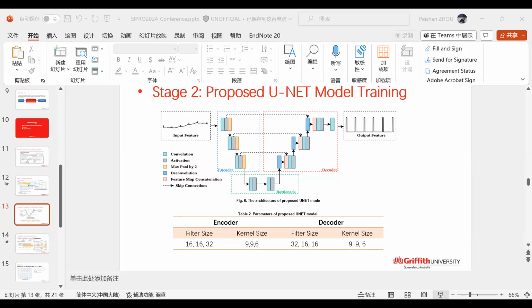It drops a bit for record R10 because we got 5 false negative predictions. These 5 false negative predictions could be caused by the large empty regions in the original database. It means that there are no beats in this area and no fetal ECG signals showing up. This is probably caused by signal loss or poor connection of the electrodes we placed on the belly.